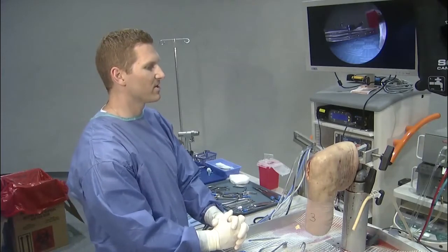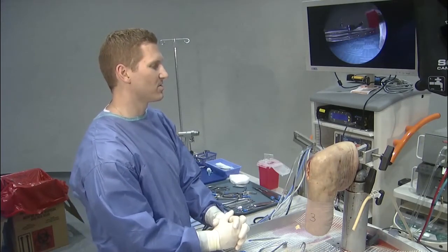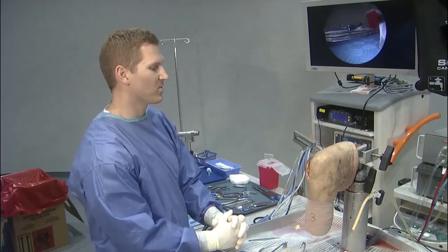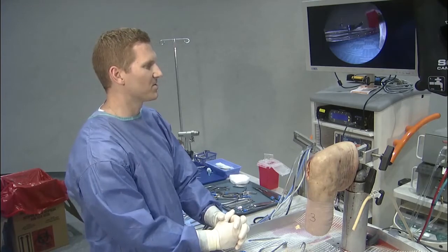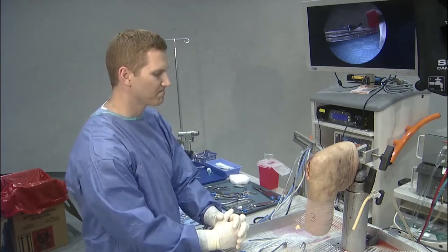That's a good question. I don't think so. I do think one of the advantages is that it's versatile. You can use it for condylar lesions. You can use it for multifocal unipolar lesions. I still think it's one of the best treatments in the patellofemoral joint. So I don't think the indications have necessarily changed in my practice, but it is a very versatile technology.